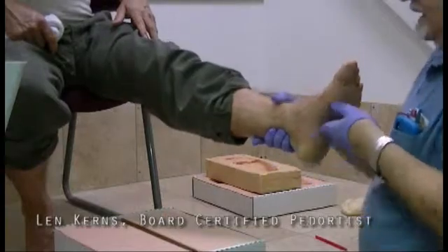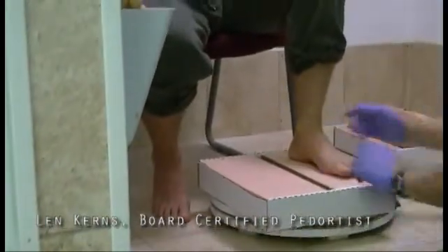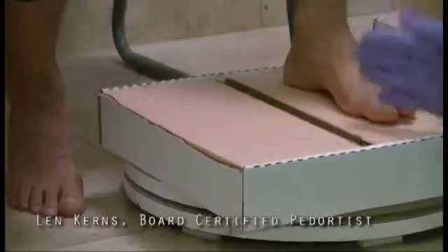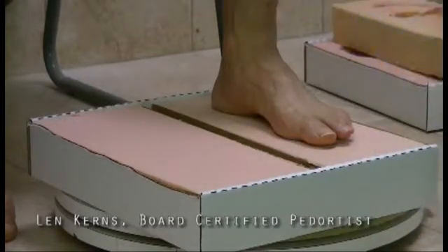And right now, by placing the foot in the middle of the foam box, especially if you're mailing it to us, try to center it from left to right. You can move the machine around, and as you can see, this patient is pronating.